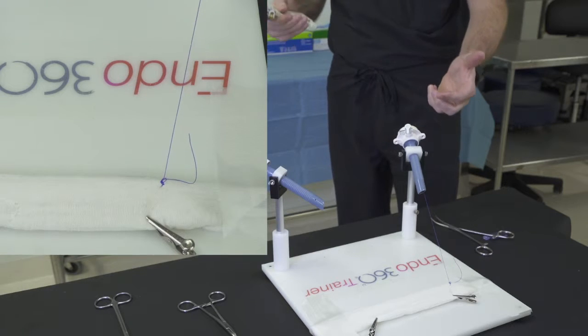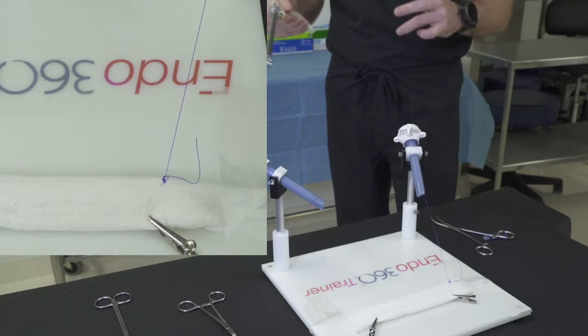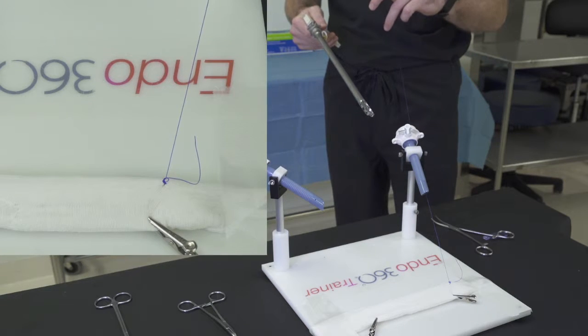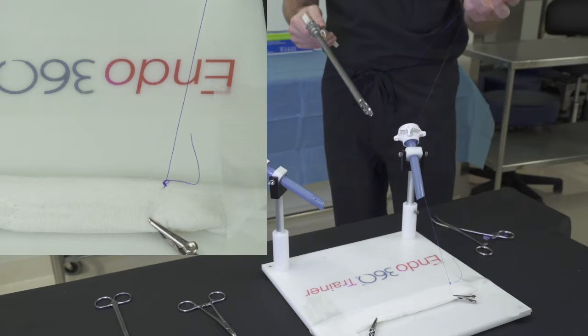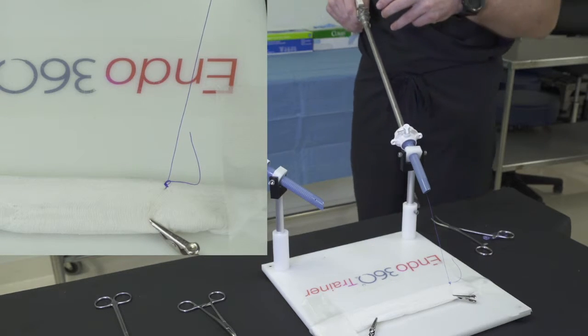For the next throws, when I enter, I'm actually going to loop my finger around the suture. I'm going to keep the tip of the instrument closed, and this hand is simply to keep all of the tension out of the suture. This is what allows me to manage the suture so that there isn't any extraneous suture interfering with our work.